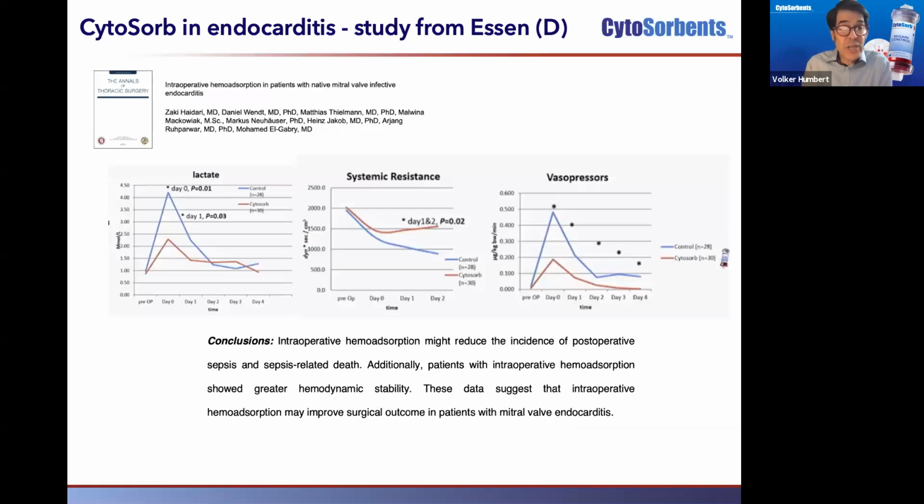So conclusion is here that due to all this, all these data suggest that the intraoperative hemoadsorption may improve surgical outcome. And as I said, we hope that the results from the REMOVE study will further support this approach.